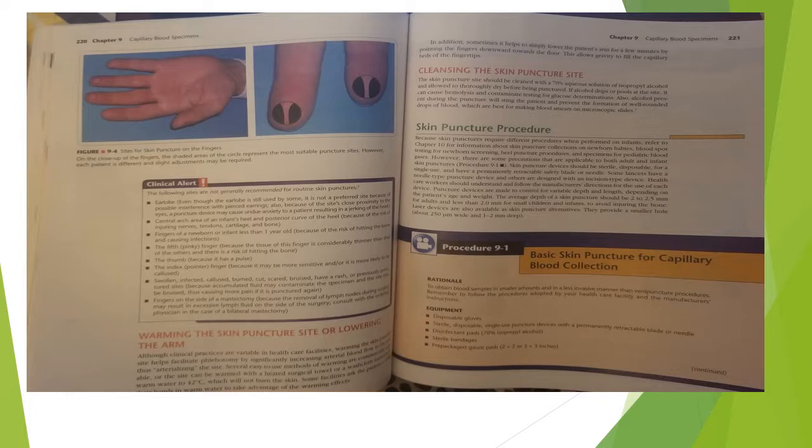Warming the skin puncture site or lowering the arm. Although clinical practices are variable in healthcare facilities, warming the skin puncture site helps facilitate phlebotomy by significantly increasing arterial blood flow to the area, thus arterializing the site. Several easy-to-use methods of warming are commercially available, or the site can be warmed with a heated surgical towel or a washcloth heated with warm water to 42 degrees Celsius, which will not burn the skin.